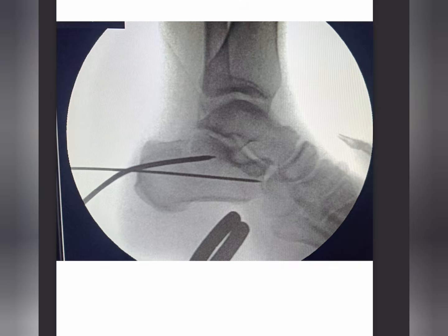That depends on the way you are approaching a case. That depends on multiple factors. The fracture line. Okay, so the first CC screw, my plan is to hold it like this. Okay, here the secondary fracture line is there. So second CC screw, my plan is to hold it perpendicular to the fracture line. This we will discuss in subsequent CMs. Okay, so that is what our plan is.